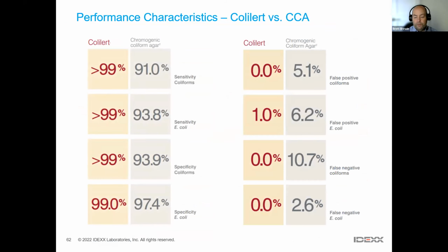We also do a lot of characterization of our methods. A lot of this data doesn't exist for reference methods, typically because they were produced many decades ago in the 1950s and 60s, and these requirements weren't there back then. But we do characterize our methods, and so we know the sensitivity of the method for various parameters. We know the level of false positives or false negatives that you might see.